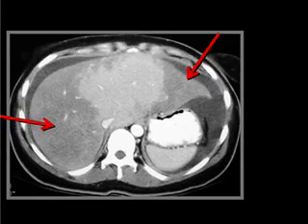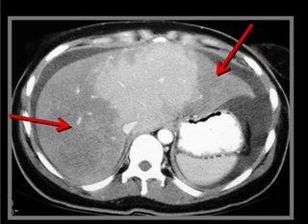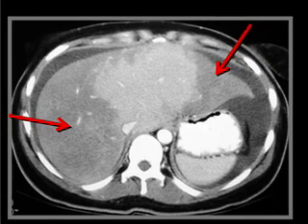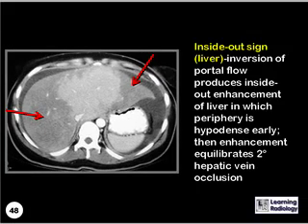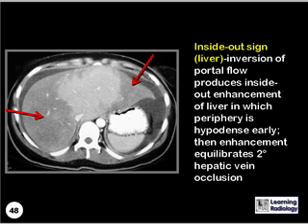What is the name of this pattern? This is the inside-out sign, which is inversion of portal flow that produces an inside-out enhancement of the liver in which the periphery is hypodense early. Then enhancement will equilibrate the entire liver and is secondary to hepatic vein occlusion.